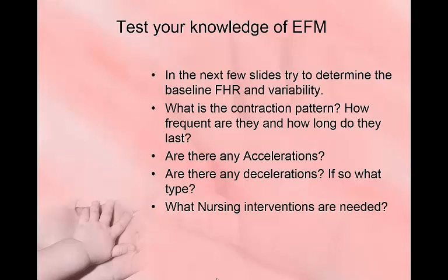How long are they lasting? Do you see periodic changes? Do you see accelerations, decelerations? If you see decelerations, what type are they? And what, if any, nursing interventions are needed for these particular fetal heart rate tracings? And like I said, we will discuss them in the classroom and go over them.